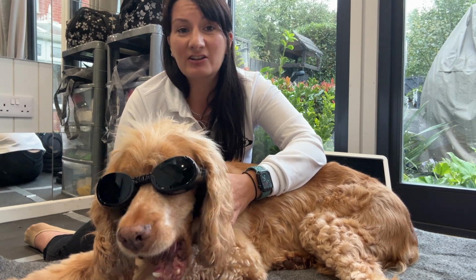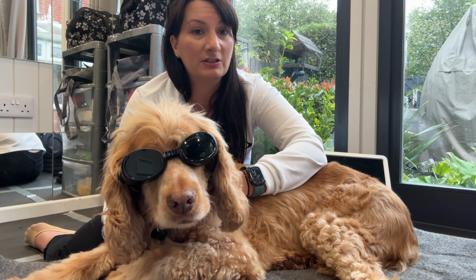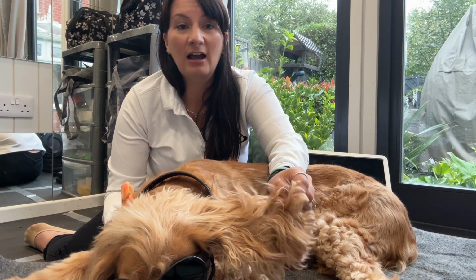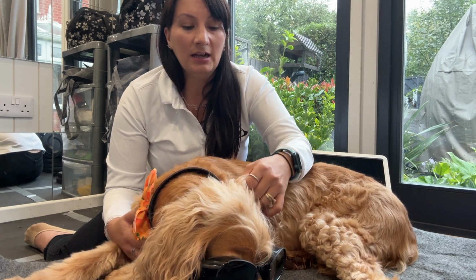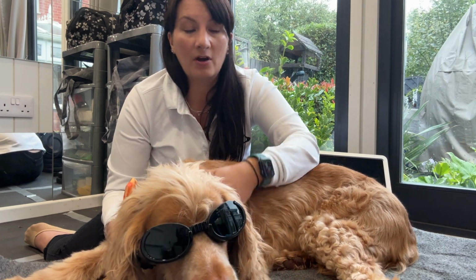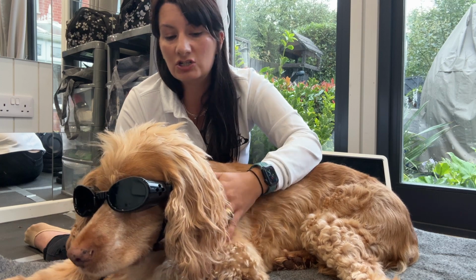Secondly is anatomically, where is my issue? Because that's going to make a huge difference. If I'm treating otitis and I'm trying to get to the ear, am I treating the inner ear and the external ear? Is it a dental condition, so I'm trying to get to either the back of the mouth, or is it just the front gingiva that I'm trying to reach?